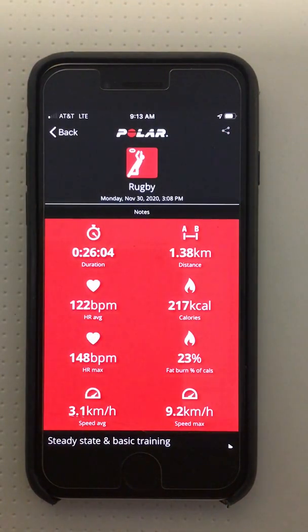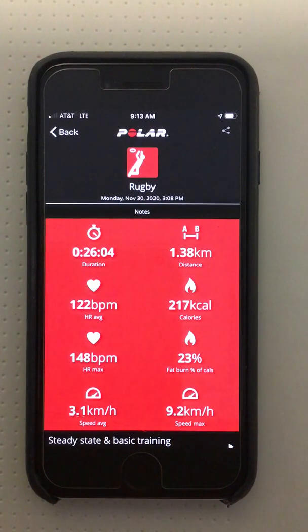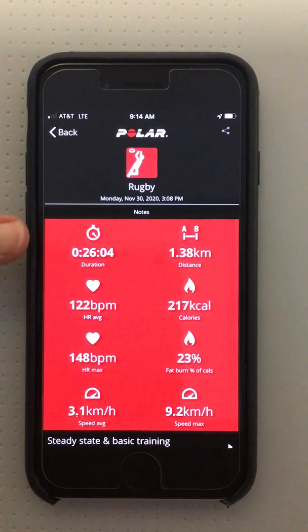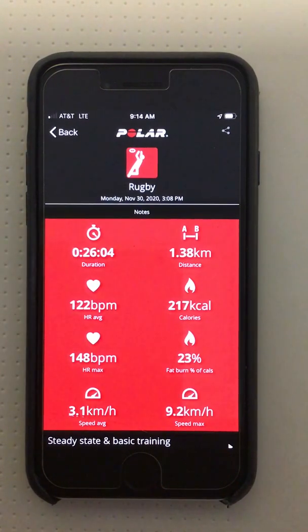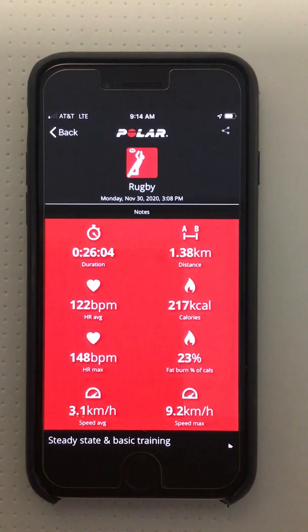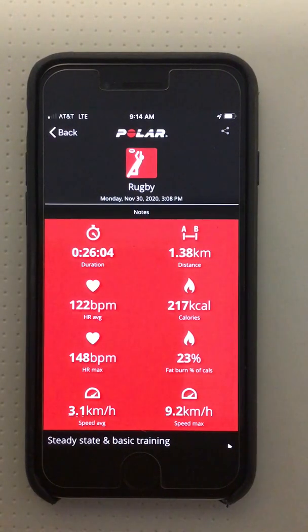This is the session data of a previous patient, a 40-year-old male. His heart rate max was determined to be 180 — that's what we programmed into the app before the session. The total session duration was 26 minutes and 4 seconds. The patient's average heart rate during the session was 122 and his maximum heart rate was 148.